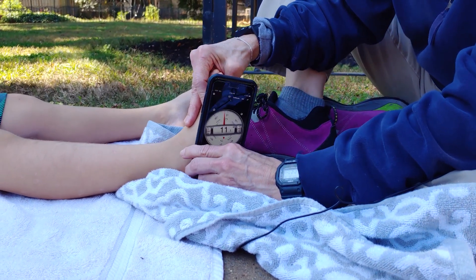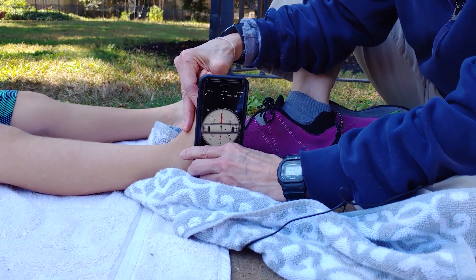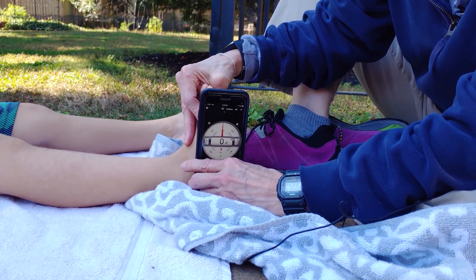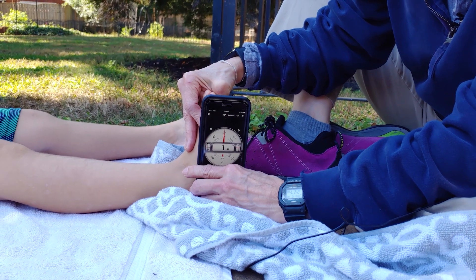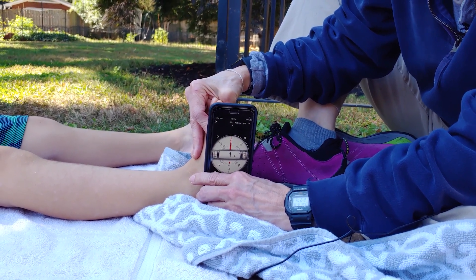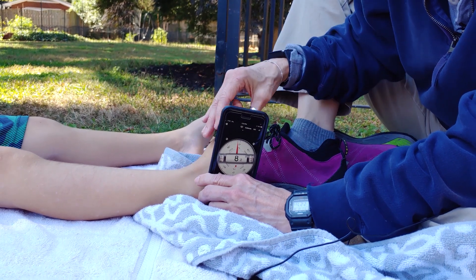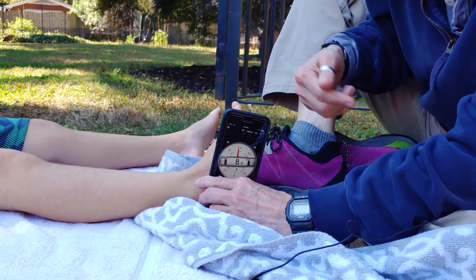This is not as exact as a goniometer, but it's certainly a functional way if you have no goniometer but have a smartphone to measure how much range of motion your child has. Normal passive range of motion is 15 to 20 degrees up and 45 degrees down.